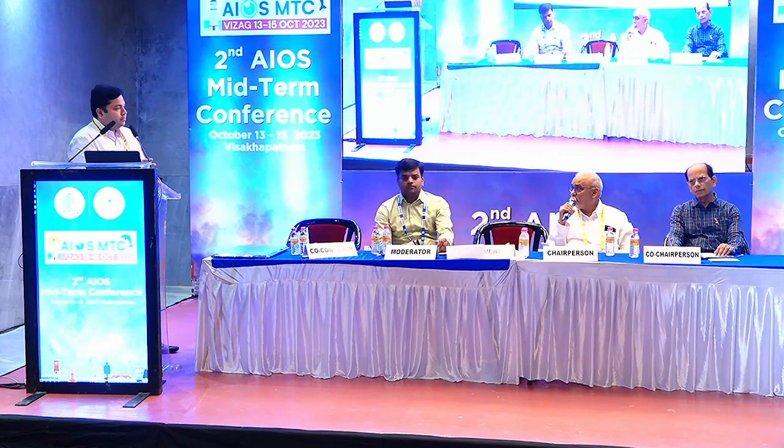But if we suspect some breach in the ocular wall, UBM will require an immersion technique. For UBM you need a fluid. Yes. So that is a very serious issue. That is the reason UBM was not used in trauma cases. Correct. But anterior segment OCT is a non-contact system. Non-contact, so that will be very helpful, and the presentation was very good.